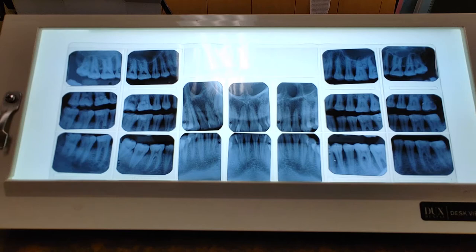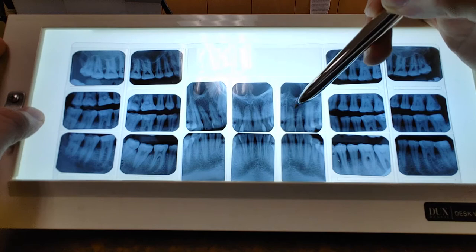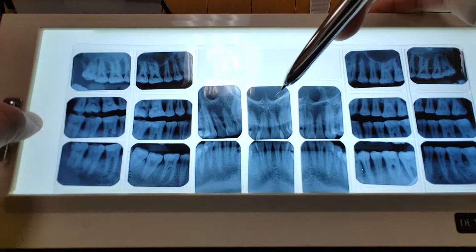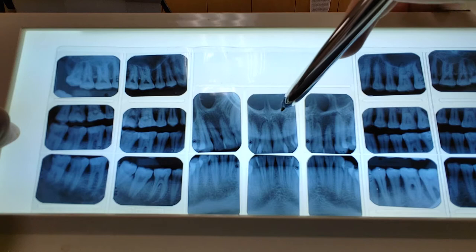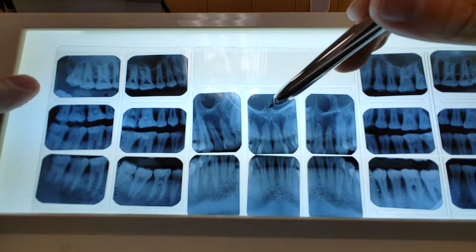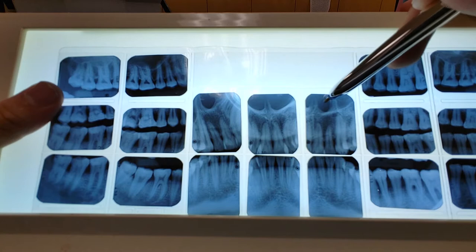Starting with the front area, our anterior set includes our canine, centrals, laterals, and canine — and it flips down the same way for the bottom: canine, centrals, laterals, and canines again. This is my patient's upper right and upper left. In the center, superior to the roots of these teeth, you'll find these hollow areas — that's our nasal septum, which splits our nasal cavities in two. These areas are essentially the holes into your nose, and you can see them pop up on both the patient's left and right sides.